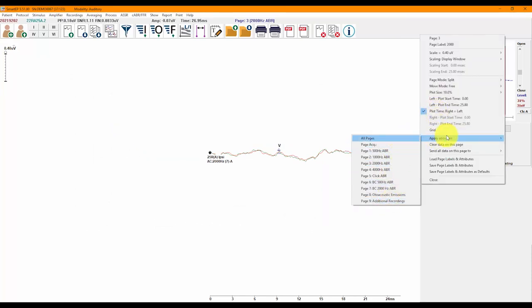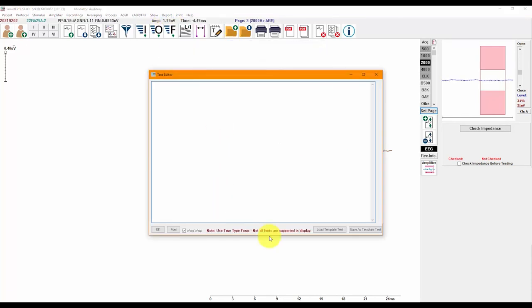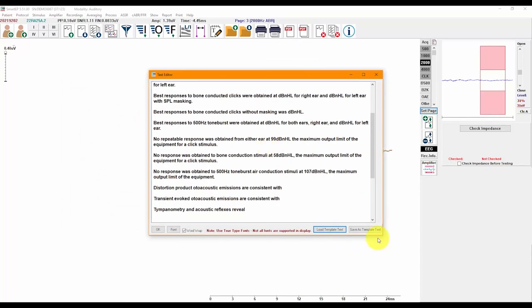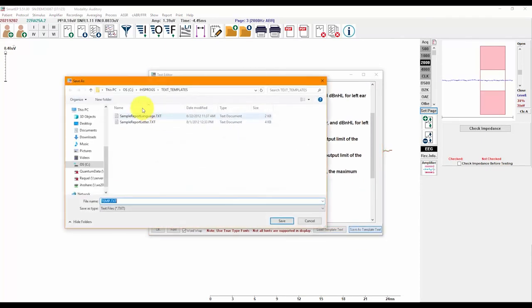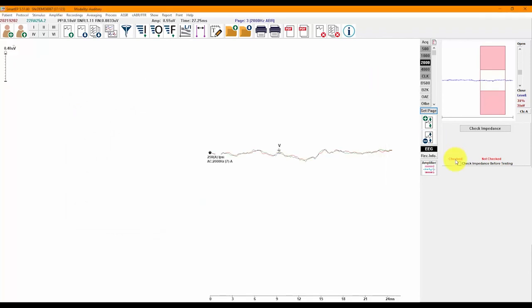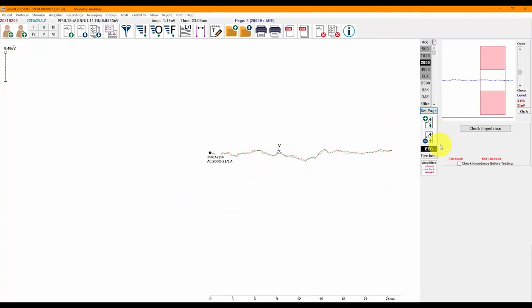I mentioned earlier that you can add notes or text to the page by clicking on the notepad icon or by going to Report > Add Text. You can also create text templates or modify one of our existing templates, which will speed up writing of the report. For those who use our OAE modules, you can also import DPoAE and TEOAE results to one of the pages in SmartEP to have a more complete report.